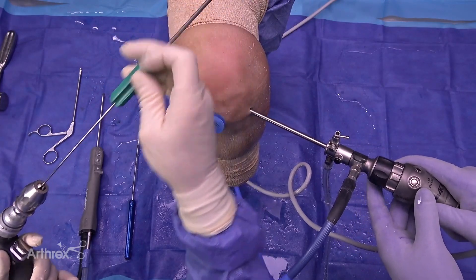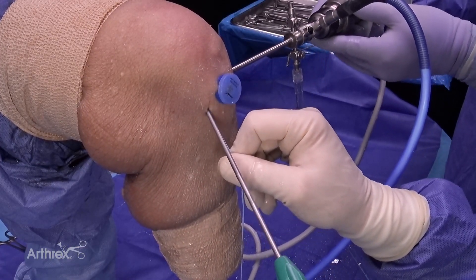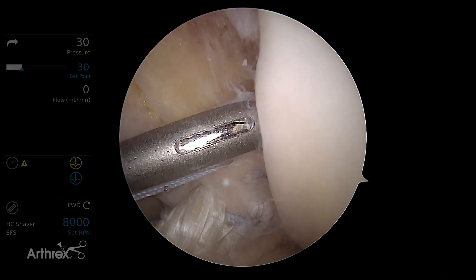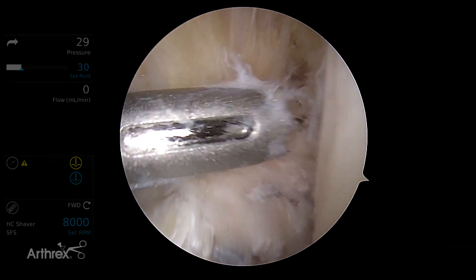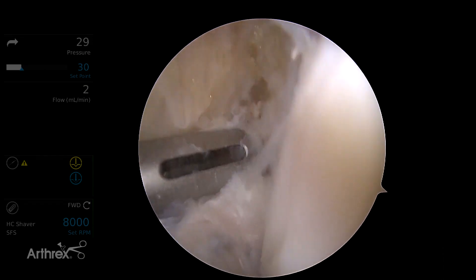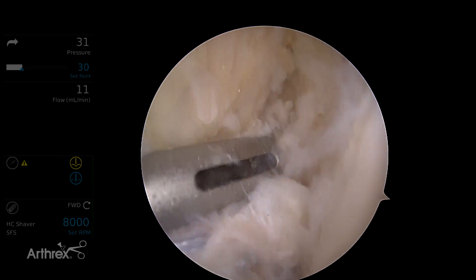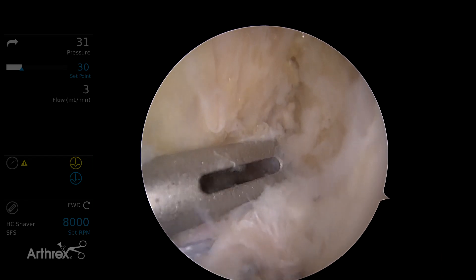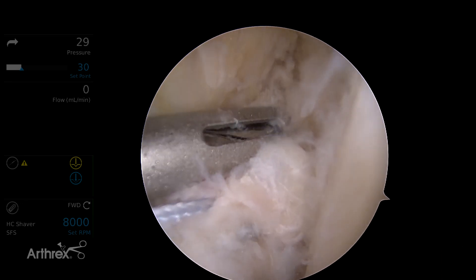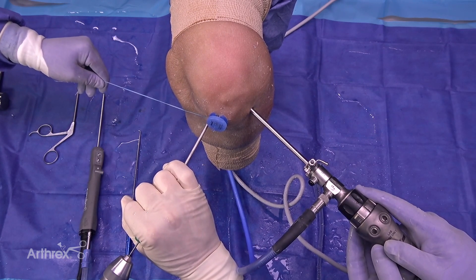We're going to get our guide and our cannulated drill — we use the same drill for all anchor points, which is convenient. This time the knee is in 90 degrees of flexion. One thing you want to make sure of is to avoid coming too anterior; we want to get in the back, so it's nice to have this guide that can ride pretty far back into the notch. It doesn't have to be right on the back wall like when doing a graft, but we can put it back here on the ridge to get good tension on the ACL. We'll drill it up, making sure we're going into the wall and not sliding down the bone — take your time, don't push too hard.